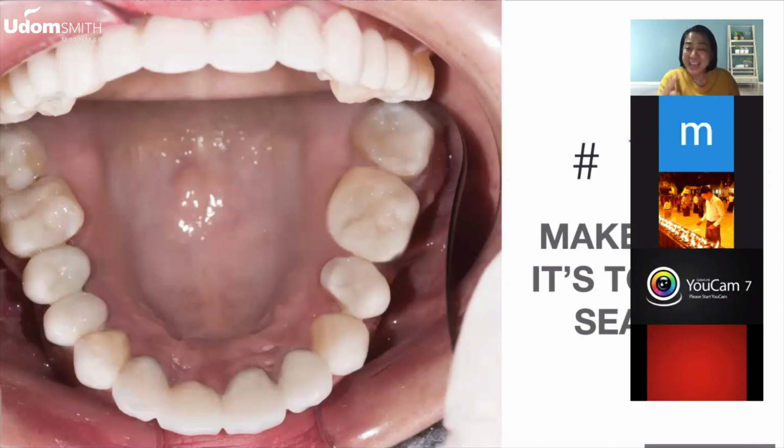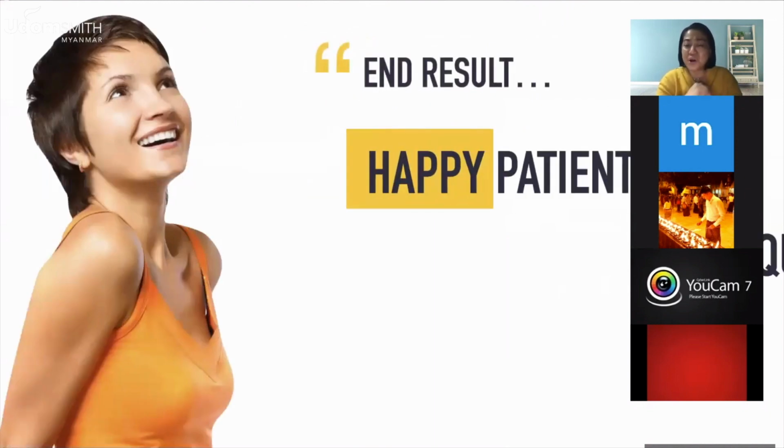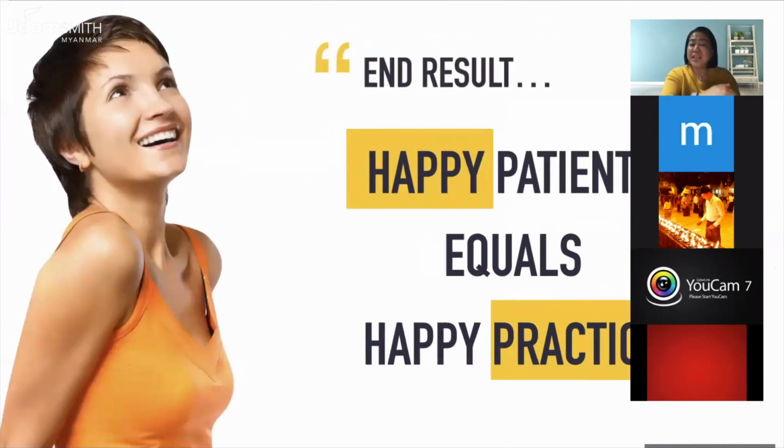Now, make sure that when you cement it, it is totally sealed. Now, as I've said, it does not stain. If it stained, it's because there's a leak and something went inside. So make sure that all the connections between the tooth, the composite, and the Edelweiss are properly sealed. Okay? So, of course, if you have a very good end result, you will have a happy patient equals a happy practice.